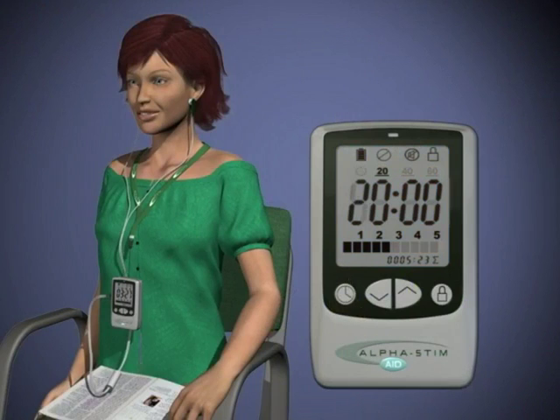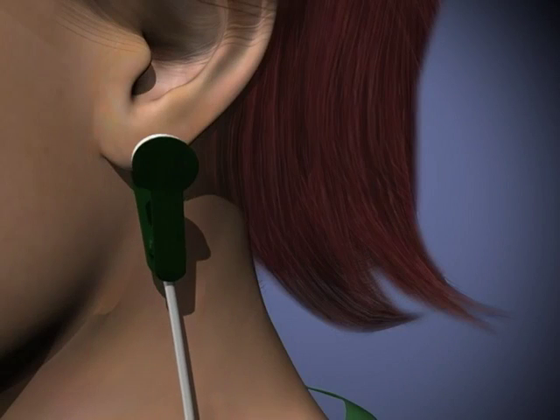20 minutes is usually enough time if the current is set to at least 250 microamperes. 40 minutes to an hour or more is recommended if the current is at or below 200 microamperes. Squeeze ear clips open and apply one to each ear lobe.